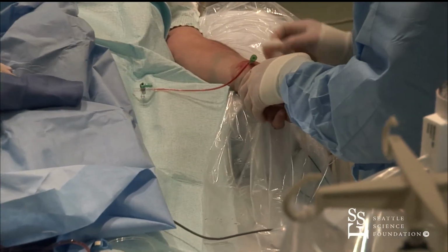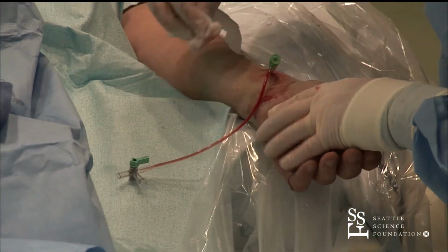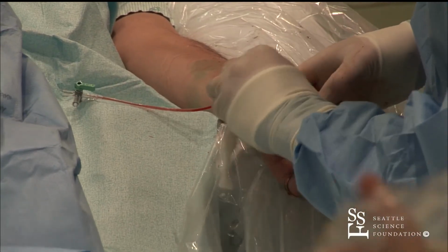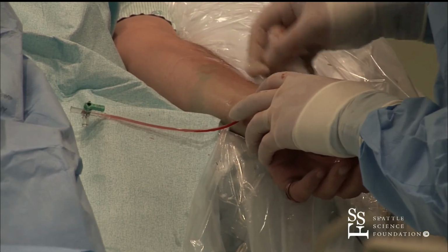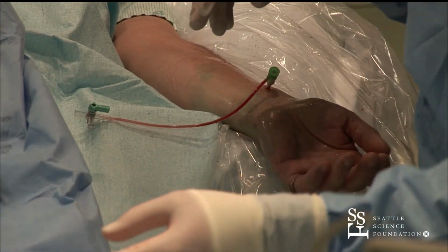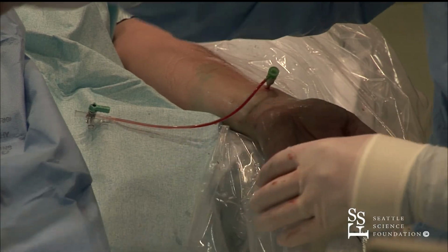So John, when you do the case from the right side, do you use Tegaderm to secure the... No. Because our fellows started to use a Tegaderm because the hydrophilic coating sometimes makes the sheath come out. Yeah, my partners have done that for whatever reason. I've been resistant to it. Maybe I'm becoming a fuddy-duddy. But the fellows introduced that.